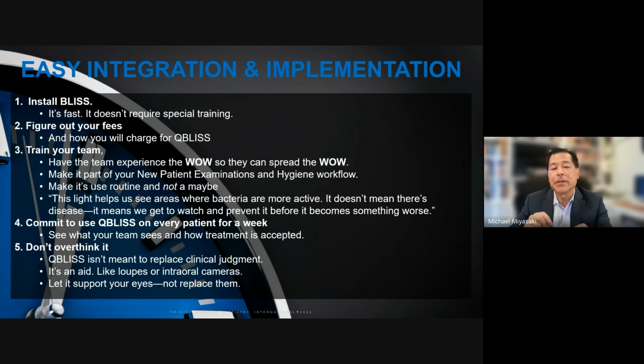It doesn't necessarily mean there's disease there yet, but it points out that those are the areas we want to watch to prevent those areas from becoming diseased, right? Gingivitis, periodontitis, or a true cavity. What you have to do also when you get this equipment is commit to use it. So if you install it and you don't use it, you never will get the value. So again, make sure that you use it and then track it.